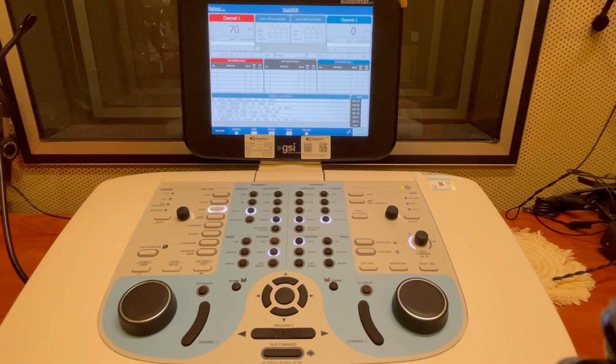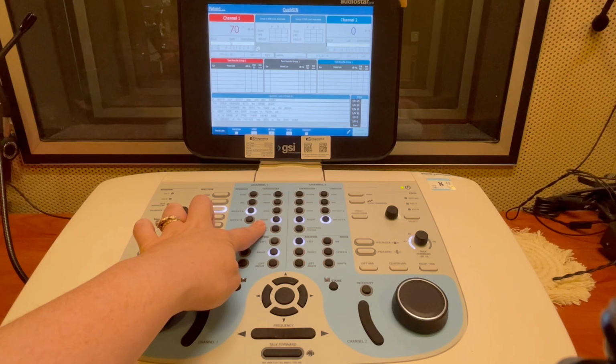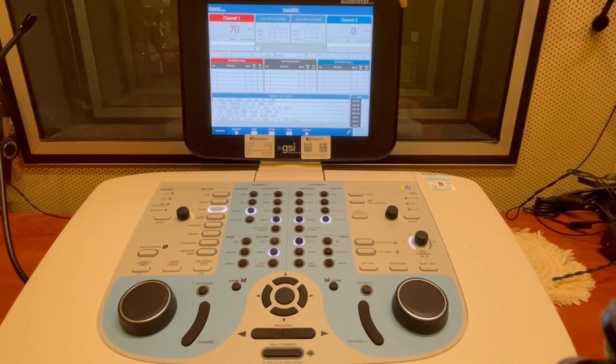And then to run this test, for my audiometer, you need to click the sentence and it'll play the sentence in that ear. So if you're looking at the channel setup, it's external A, inserts is our transducer, and we've got the right ear. You can score this, so it's out of 5, and it's the words that are all capitalized. So a white silk jacket goes with any shoes.